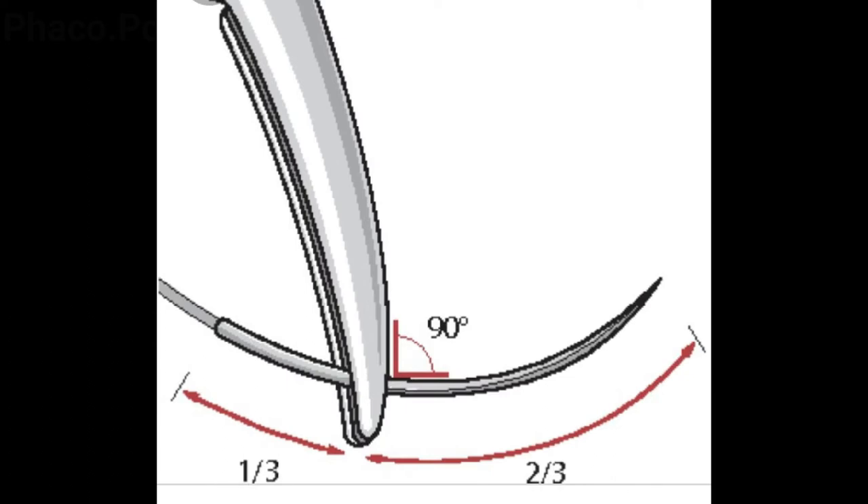The needle holder should grasp the needle two-thirds away from the tip, and it should hold it such that it makes an angle of 90 degrees to the body of the needle holder.